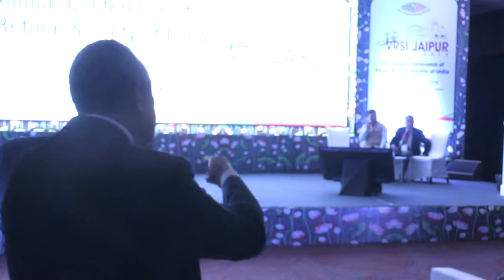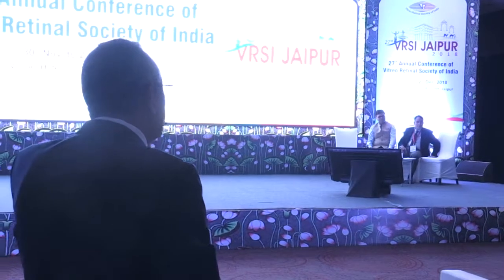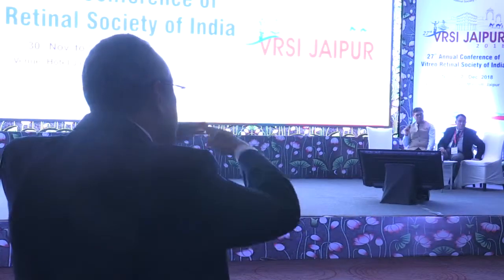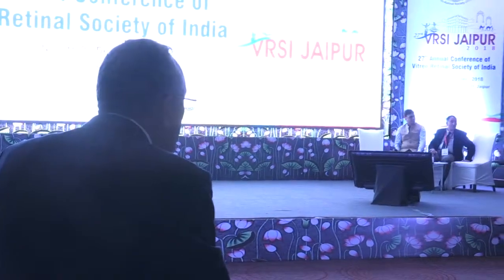Because of the stiffness, especially in chronic folds, I mean folds that have been there for 2 or 3 weeks, peeling of the ILM can be very useful in helping the retina flatten back in the posterior. We come across these folds very commonly in GRTs actually. The cases with a giant retinal tear injected with gas post-operatively have these folds. If it is not passing through the fovea, we don't do anything.